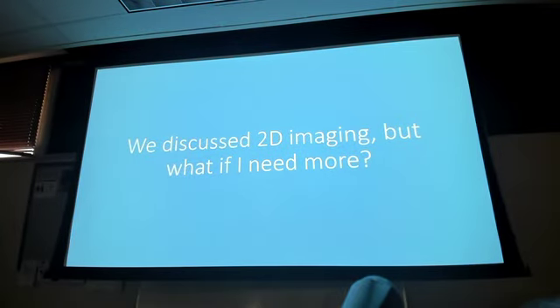Two, right? It's kind of a trick question because we haven't really talked about it yet. We talked about this, more of a reminder that your plain film x-rays, each image individually, is a 2-dimensional image. Your brain is going to want to try to make it 3-dimensional, but it is not. It is only 2-dimensional. You have no depth on any particular single x-ray image, none whatsoever. So what do we do if we need more?